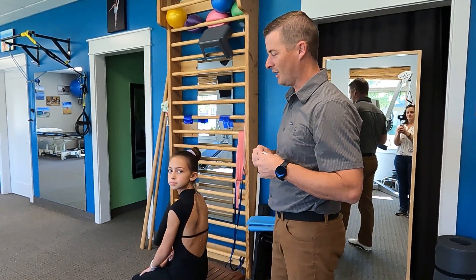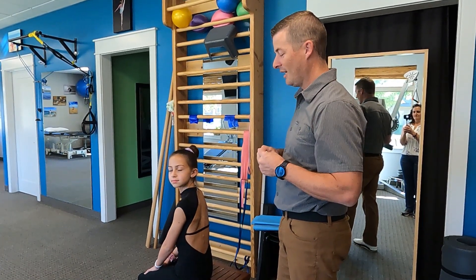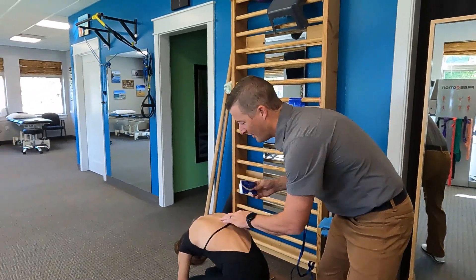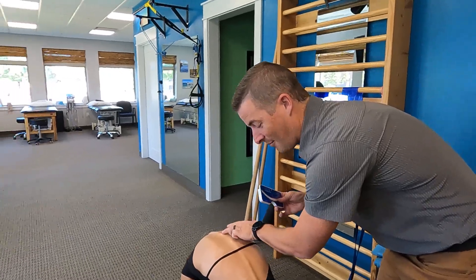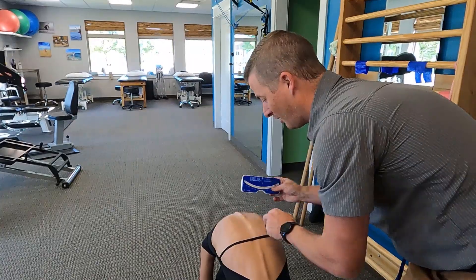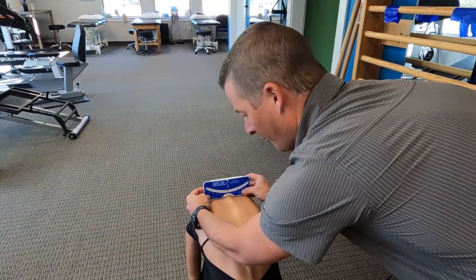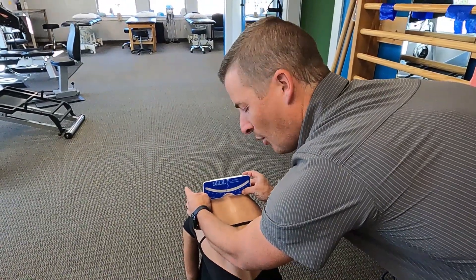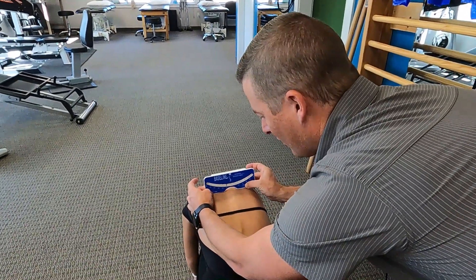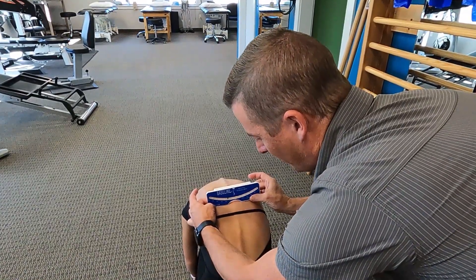So Sammy here has agreed to help us out with showing a scoliometer. Go ahead and lean forward, Sammy. So she's going to lean forward, and we can see her spinous process very easily. As we look down through here, we're going to put that notch right in the middle, over the spinous process. Then we're going to keep both hands on the scoliometer — that's going to be important. As we bring it down, we're going to go for the maximal reading on the scoliometer.